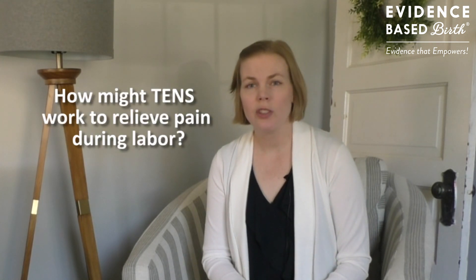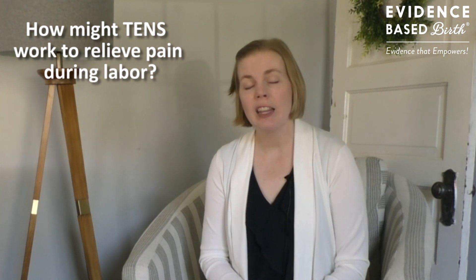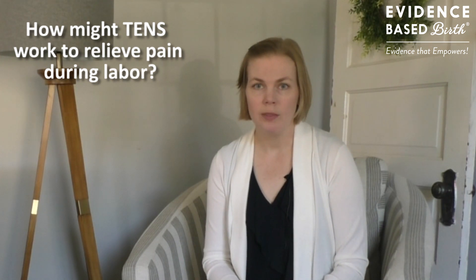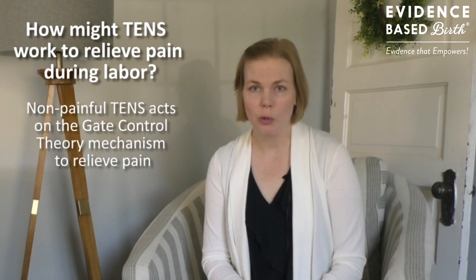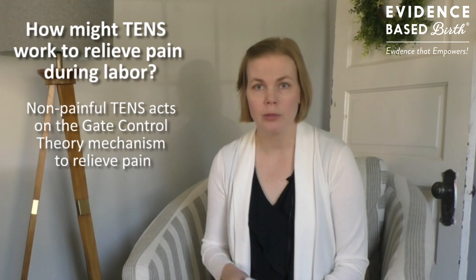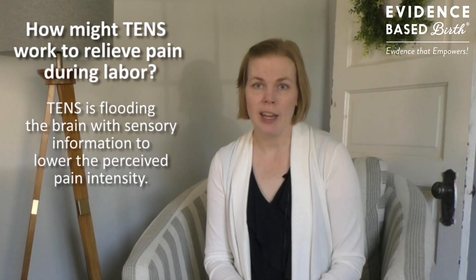So how might TENS work to help manage pain? Researchers think that TENS might work by changing how a person perceives their pain. I highly recommend going back to watch our video all about the overview of pain management during labor, where we talk about the different ways that pain management techniques might work. When you use TENS at a low intensity level, it probably works through something called the gate control theory, which says that there's only a certain amount of stimuli that can get through to the brain. You're flooding the brain with a sensory buzzing feeling from the TENS unit so the brain can't really perceive the labor contraction pain as much.